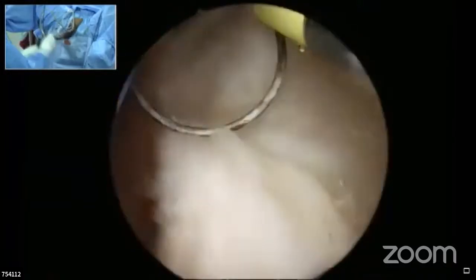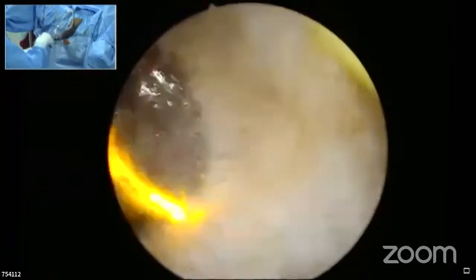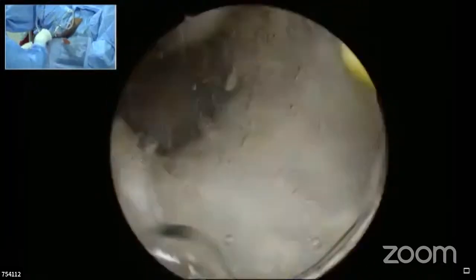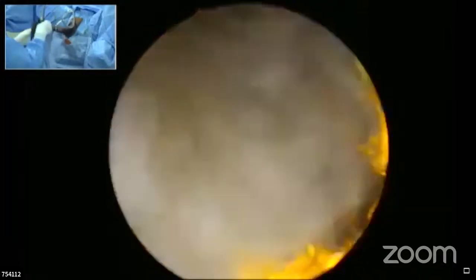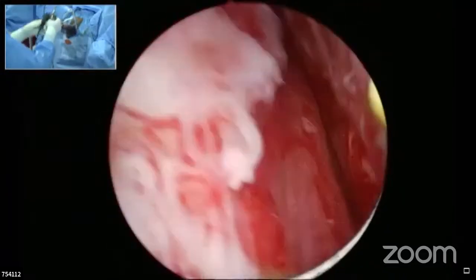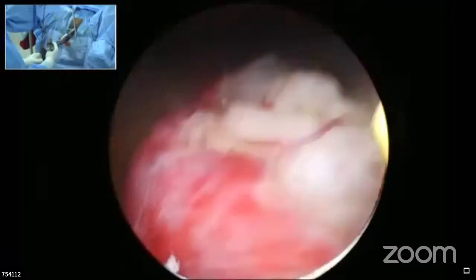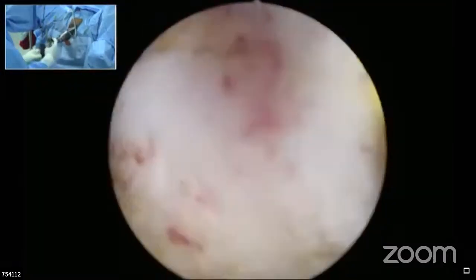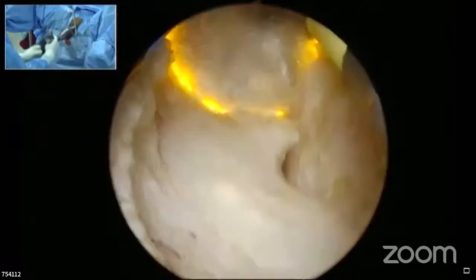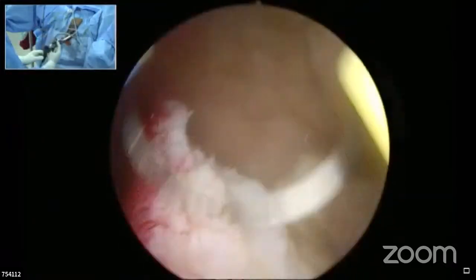And sometimes you put a balloon in the bladder, and then you can put a finger in the rectum and ask your resident to press the prostate. Wait 5-10 minutes. Automatically, it becomes completely clear. So you have to wait in the theater only. Once it becomes clear, then only you shift the patient. Otherwise, you may have to go back to look in again.